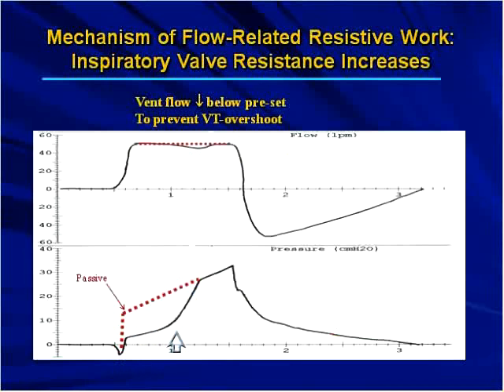So this is classical. And what's not appreciated, and it's subtle in this picture here, is that as the patient tries to suck gas out of the ventilator faster than it's programmed to deliver, the ventilator flow rate will actually go down below preset to try to limit the tidal volume. So this puts a huge load, or can put a huge load, on the patient's muscles.